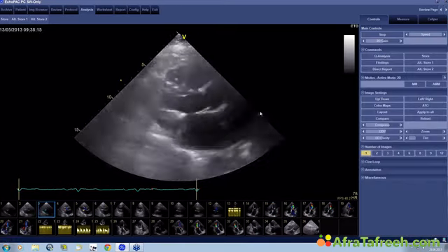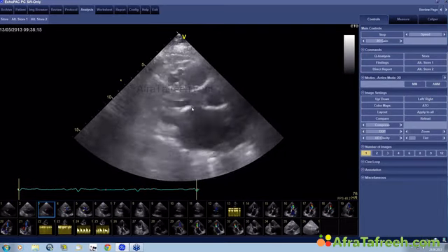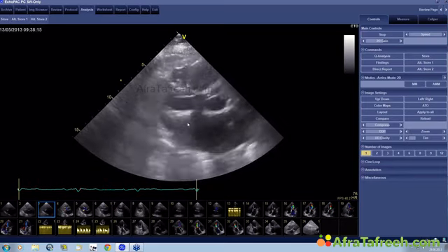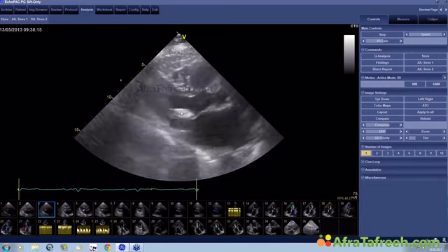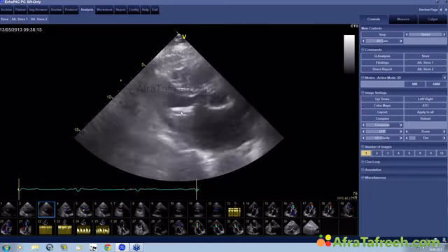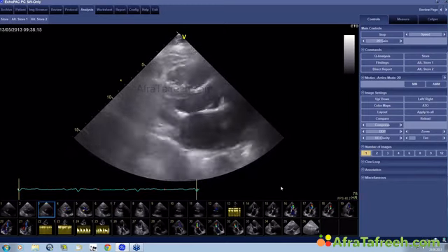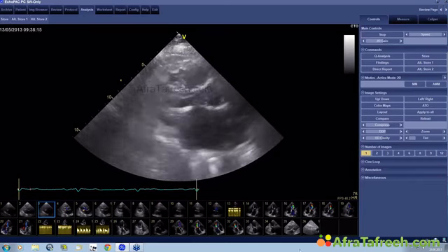Remember, when we looked at the short axis view, there is still a lot of doming, so the basal and mid portions are moving quite okay, but still it would add up to 2 or 3 maybe, I would say. And so we'll have a Wilkins score in the range of maybe 10 or 11, which is fairly high. So this is not the ideal candidate for valvuloplasty, but still, it's in the range of something that you might want to do.